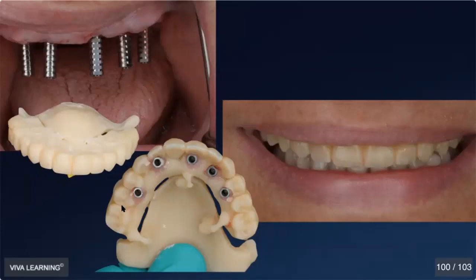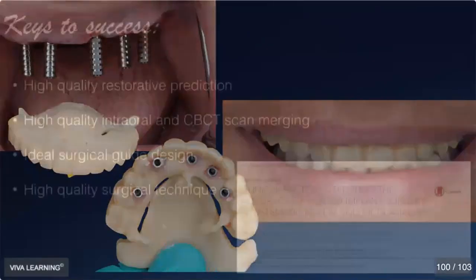And from the dual scan, we basically just created a 3D rendering of the denture that she was wearing and 3D printed that, and included the emergence access from where the holes would be for creating this prosthesis. So compared to converting a chairside denture to a fixed hybrid prosthesis, you can have this in hand before you even start the case. Makes it really, really easy. So, cool stuff we can do with this technology.